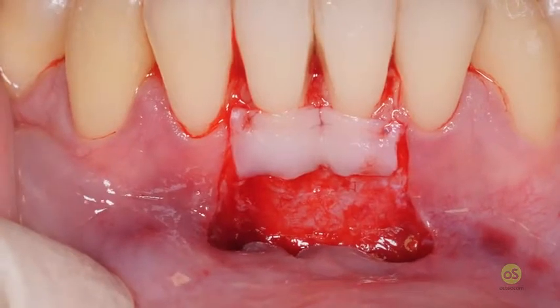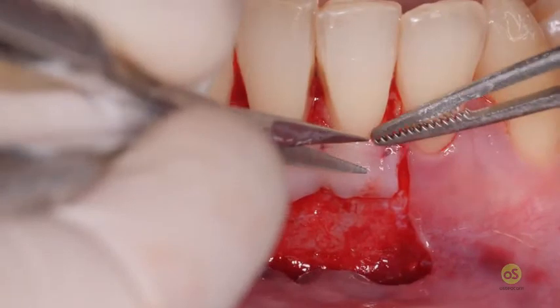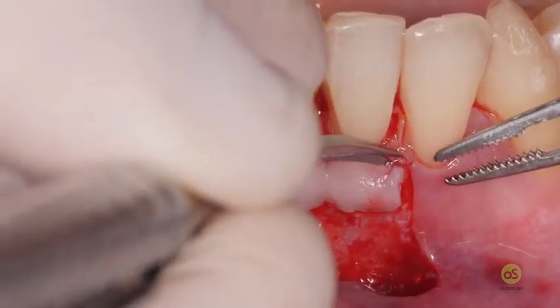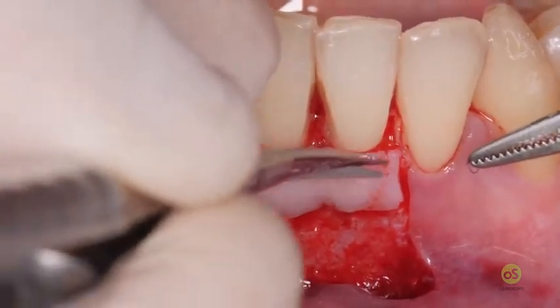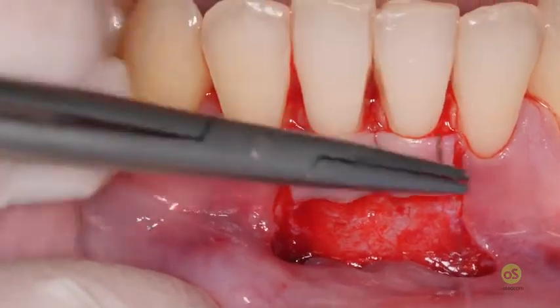This surgery is really very, very precise surgery. Don't leave anything to heal, so it was not well adapted in this area.